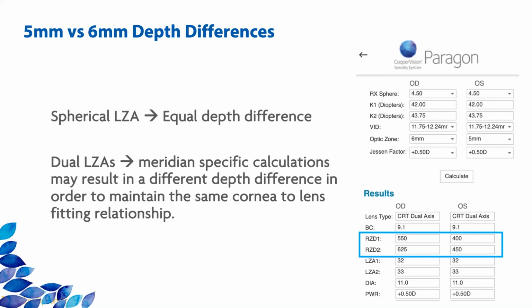And this is only relevant when I see a decentration post ortho-K fitting, and I want to tell whether this is truly a decentration that I need to fix, or this is most likely a pseudo-temporal decentration because of the uncorrected angle kappa. So to answer this question, no, you don't need to have an angle kappa corrected baseline topo, but keep in mind that we only have one chance of getting a good baseline topography. So I would urge everybody, if you're not too busy, probably get 2 different sets of topography, one with central fixation, one with nasal fixation, for those with significant angle kappa.